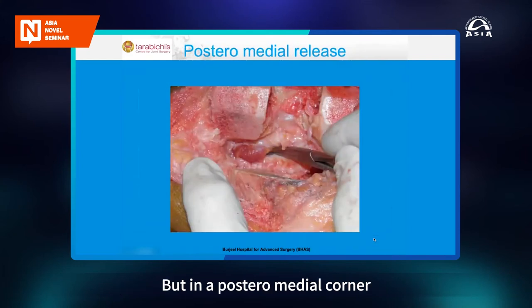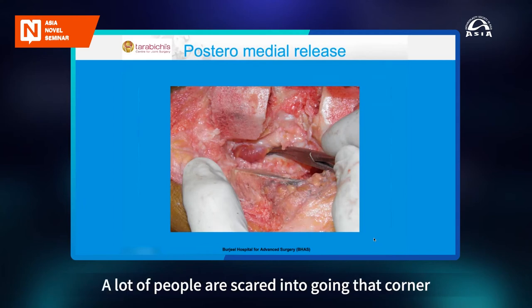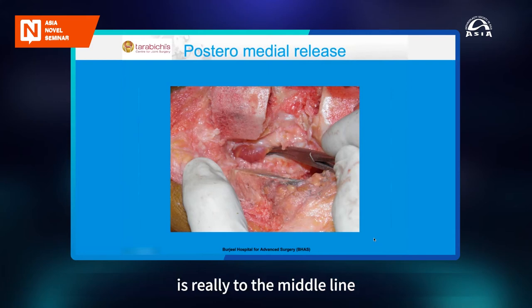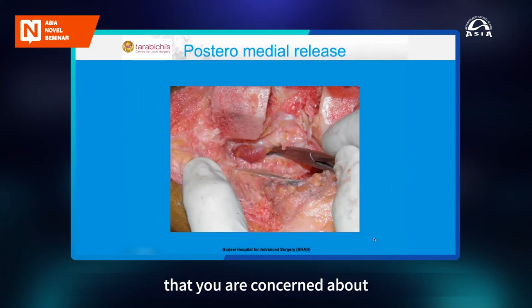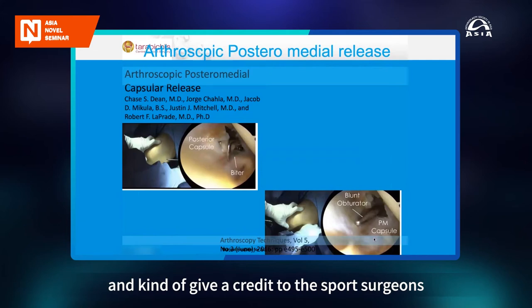But in a posteromedial corner, sometimes you have to excise the posteromedial capsule. And this is what I'm showing you here. I have reached the muscle. A lot of people are scared of going to that corner. Well, they worry about the vascular structure. Yeah, but the vascular structure is really to the midline and more lateral. You have to remember that there is a good muscle that can protect you from the valuable structure that you are concerned about.